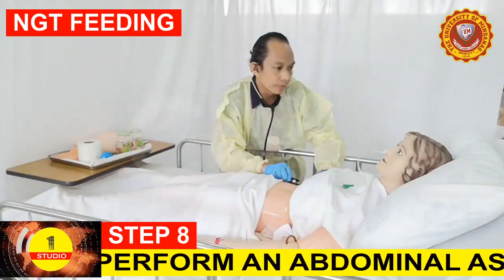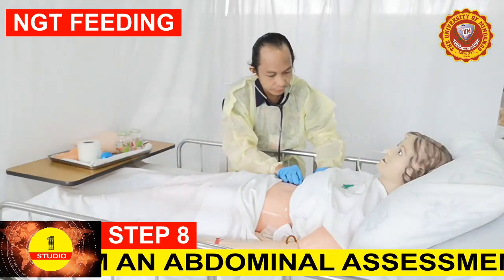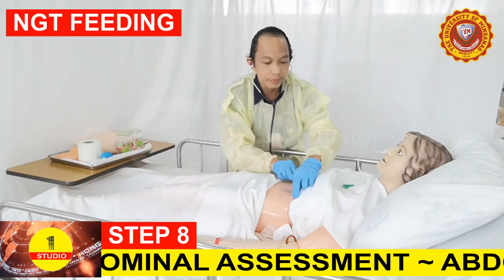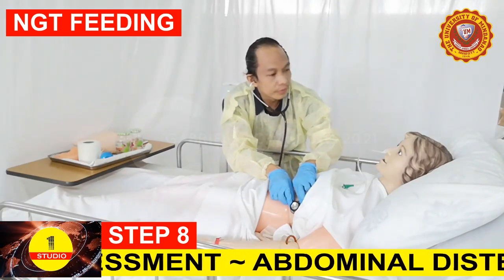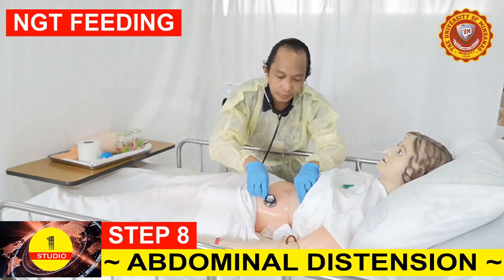Step 8. Perform an abdominal assessment. Check for presence of abdominal distension, hypoactive or absent bowel sounds, pain, nausea, vomiting, and diarrhea.